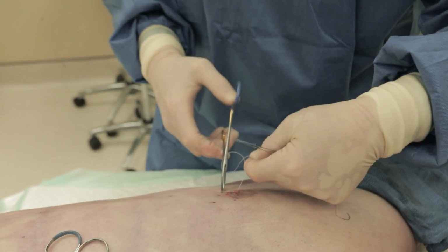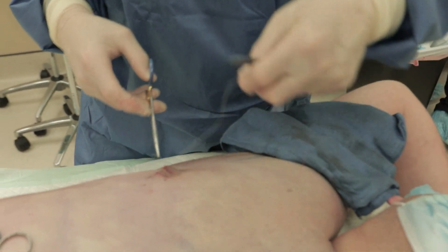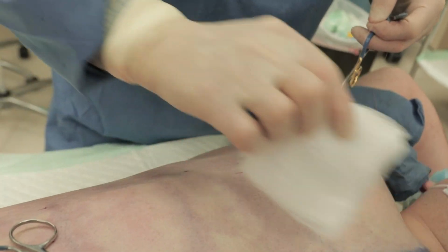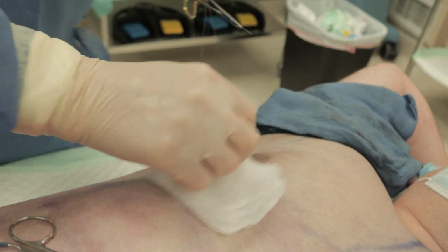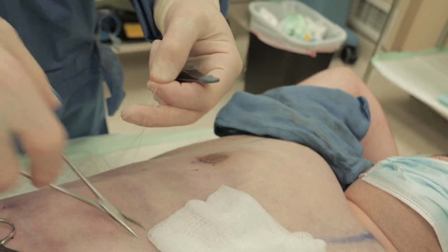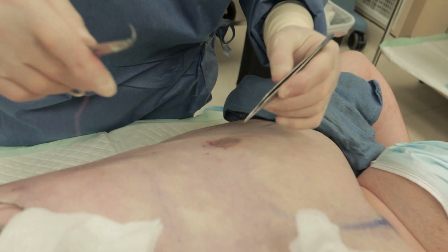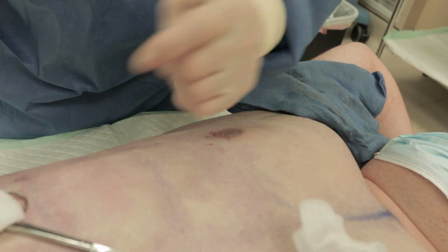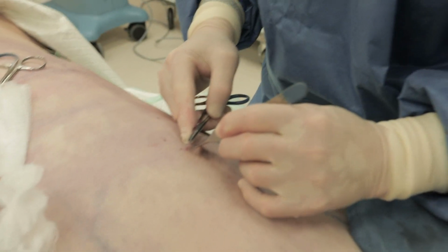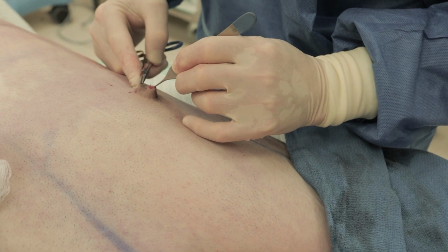And a little bit of scar tissue will form, as it always does. One of the biggest things about gynecomastia surgery, you gotta resist or inhibit that scar tissue from forming. But it always does, and we sometimes have to fight it with steroid injections or massaging and rolling and compression garment. But it's always going to form a little bit. So this side, one more stitch. And we're done. And the other side's a little bit smaller, so a little bit smaller of a nipple reduction.